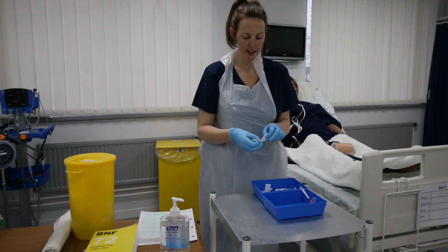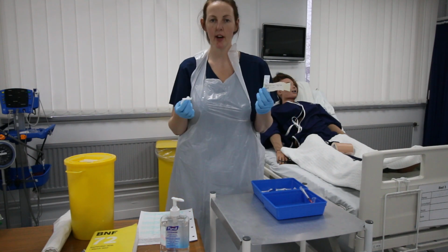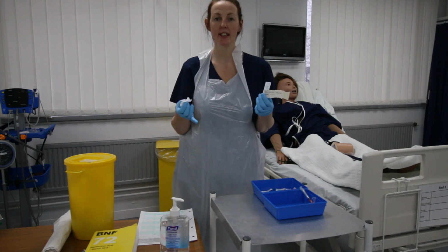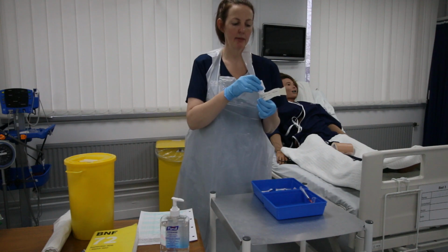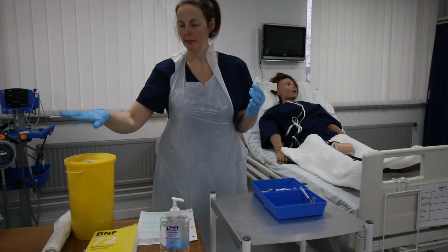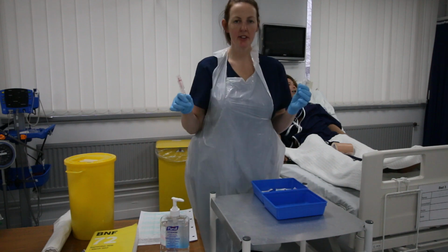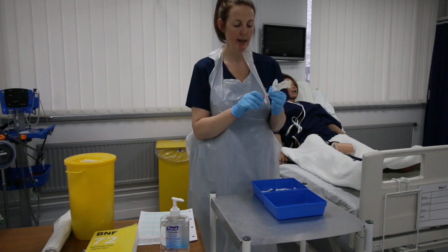I'm going to get one of the pieces of gauze and I'm going to open my glass vial. Yes, I know it's plastic, but we're going to pretend for the purposes of OSCE that it's glass, and I'm going to treat it like it is a glass sharp. So with some gauze, I'm going to break it at its point, and I'm going to discard it straight into the sharps bin. I'm now going to get my syringe and draw up more than the required amount.